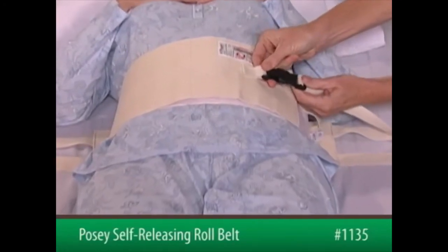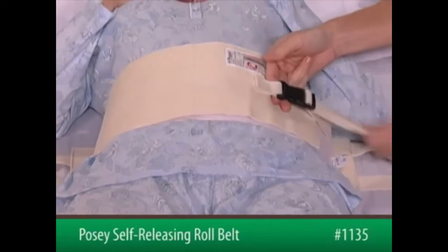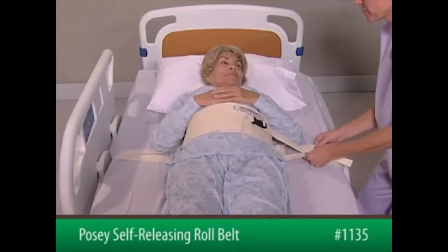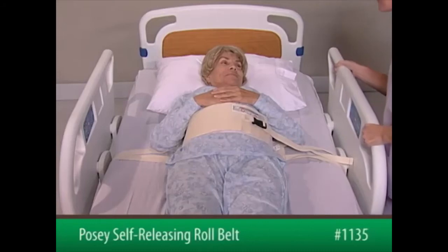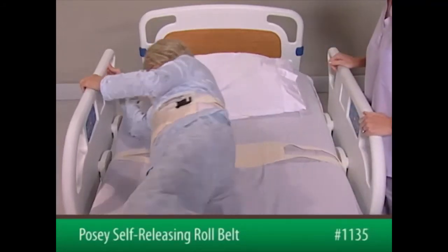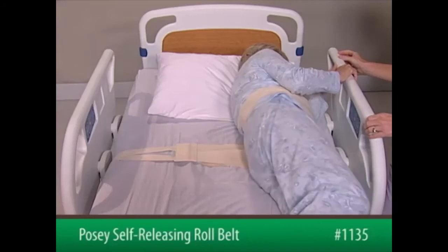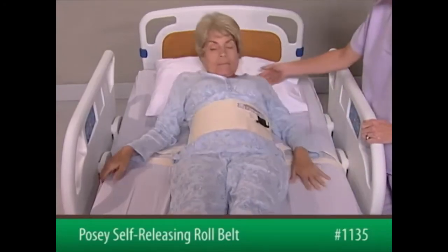Connect the quick-release buckle. Insert 2 fingers flat under the buckle and pull the strap snug but not so tight as to restrict circulation. Check that the straps are secure and will not change position, loosen, or tighten if the patient pulls on them or if the bed is adjusted. After the belt application, the patient will be able to roll from side to side and sit up in bed.